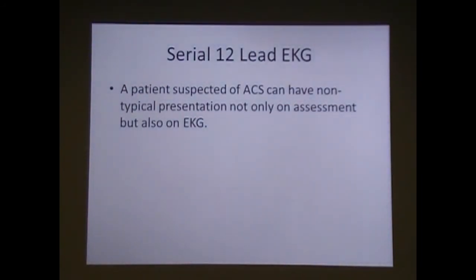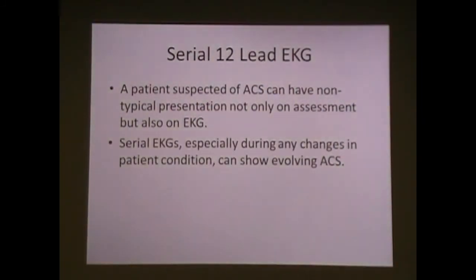Okay. Two, sometimes we'll give TPA at the outlying hospital, for example, and I'll be shown whether it's resolving. If it's not resolving, they're going to be like, hey, he's got TPA but not resolving, straight to the cath lab. But if it's the subtle things like that person who was at the festival in the desert, that just subtle increasing ST elevation, they're going to be like, yeah, let's go. So you're going to help us decrease our delay to treatment by showing us this evolving clinical picture.